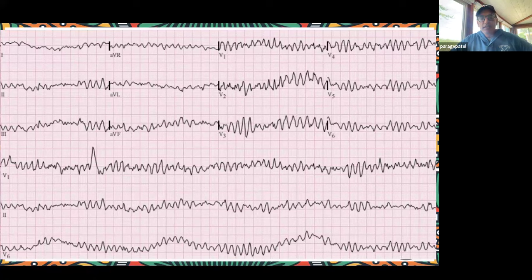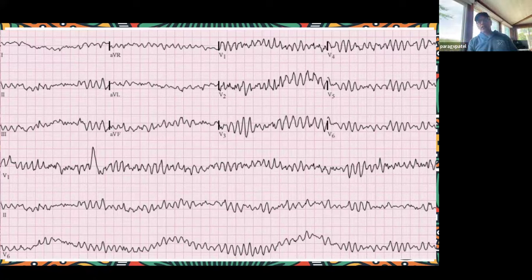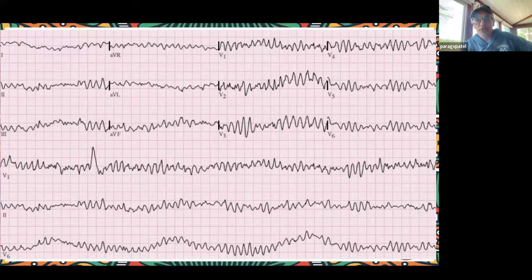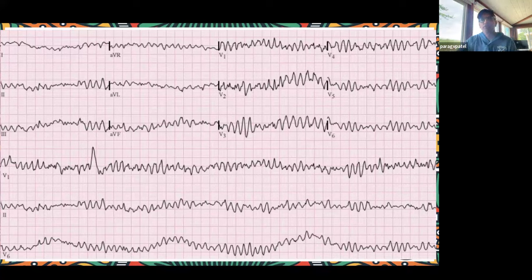We're hearing torsades, we're hearing V-fib. Excellent. And it really doesn't matter what you call it — this is a life-threatening rhythm. There is no medical therapy that is going to save this patient. It requires immediate assessment that there's no pulse, cardiopulmonary resuscitation, effective chest compressions, and then somebody getting help and getting a defibrillator to shock this patient. Without a defibrillator, this rhythm is not going to perfuse the brain and the patient is not going to survive.